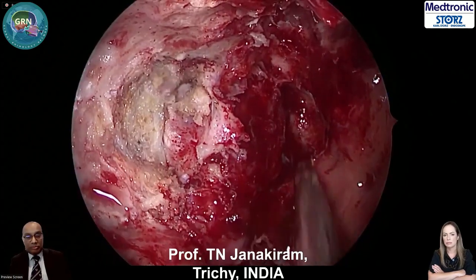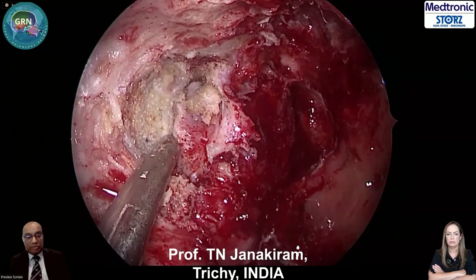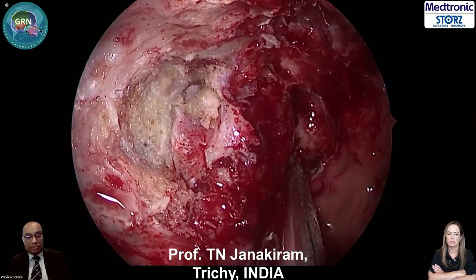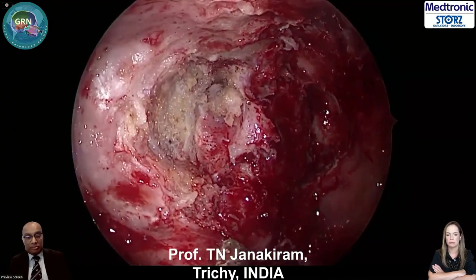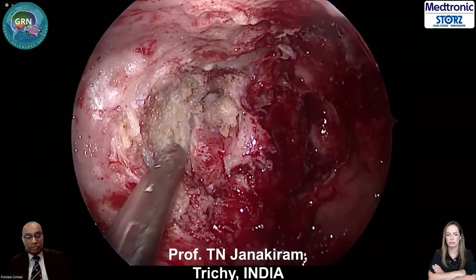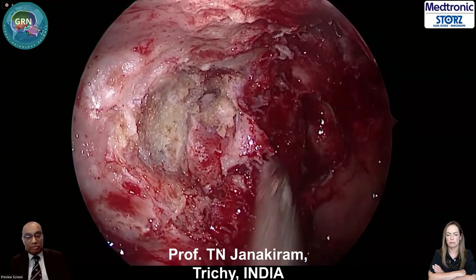Can you see here? Yes. So it's between the lateral pterygoid plates. That's the sphenoid sinus. That's the skull base. This is the anterior margin. So I got it. I just have to get this IMAX. If I clip this IMAX here, this guy is dead.